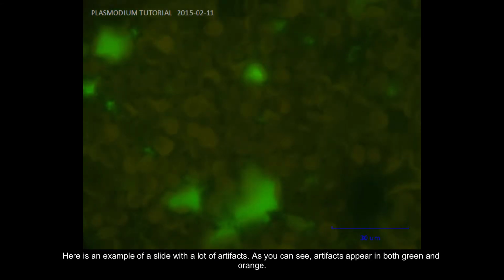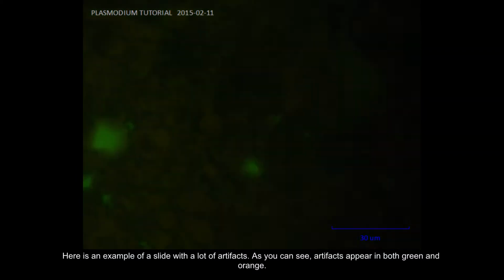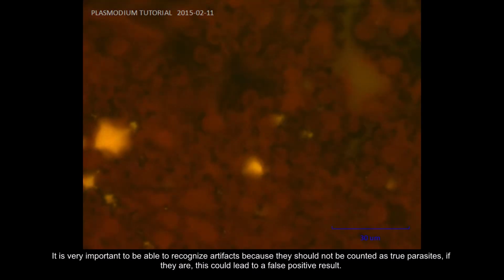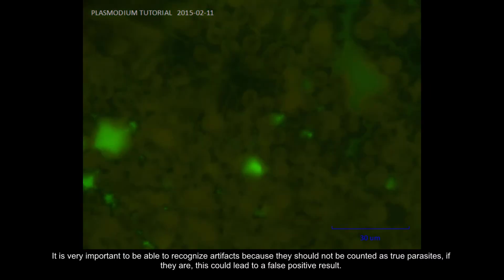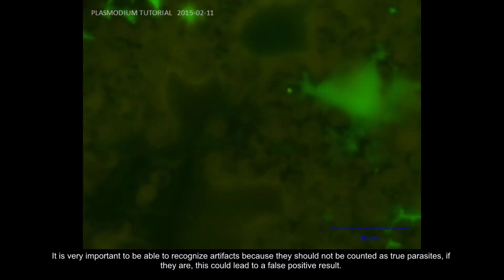Here is an example of a slide with a lot of artifacts. As you can see, the artifacts appear in both green and orange. It is very important to be able to recognize artifacts because they should not be counted as true parasites. If they are, this could lead to a false positive result.